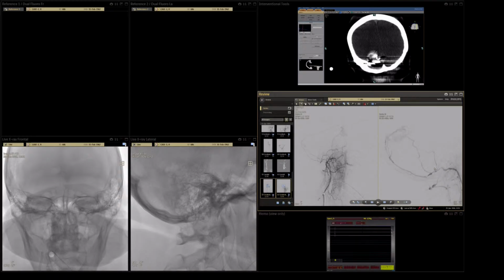We used to use Y connectors from Bolt, that's why we're saying Bolt Y connector. Sure.